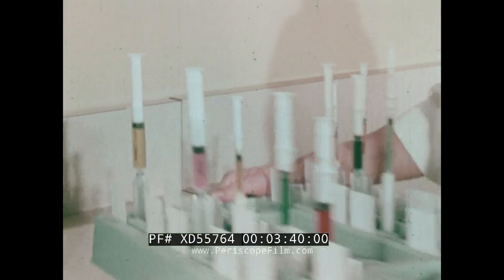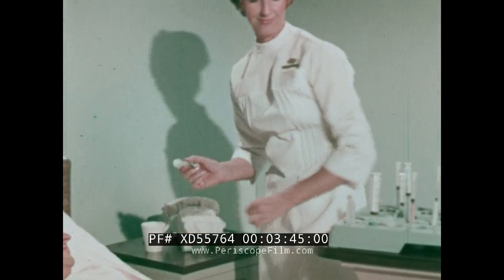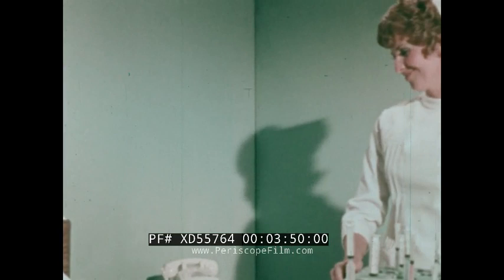The unit is then placed on the monotray for delivery to the patient. After the injection is given, the contaminated unit is safely returned to the sterile platform with a simple one-hand motion. There is no chance of accidental puncture when resheathing the contaminated needle.